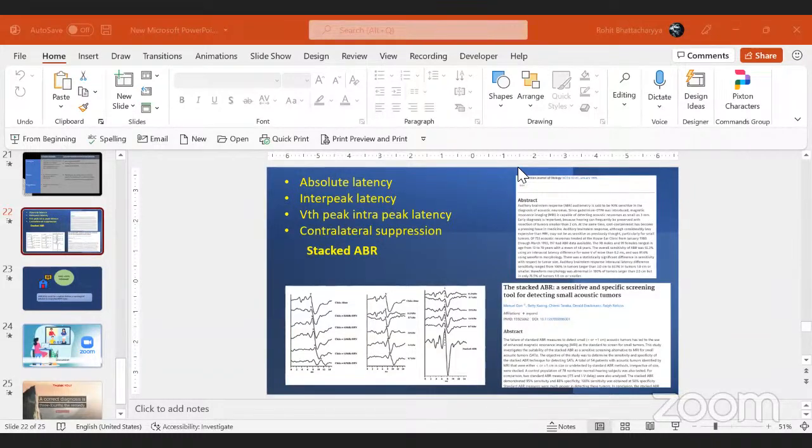Sir, how much is it related with the pathology? If we get an ascending type of audiogram, is it really indicative of a retrocochlear pathology? No, we have to correlate with everything, sir. Like the speech scores, definitely, then reflexes, then the air-bone gap. If there is no air-bone gap and it's an ascending type, then definitely we can suggest not just retrocochlear pathology.